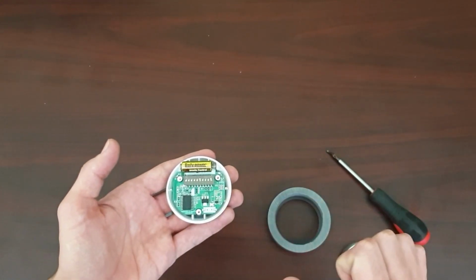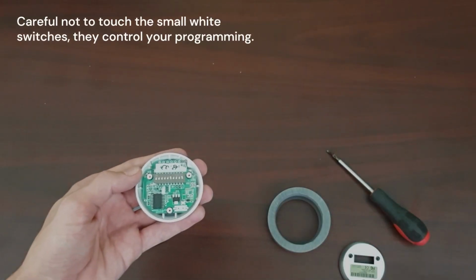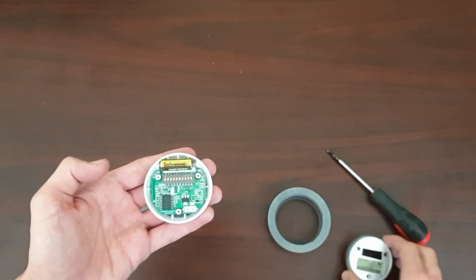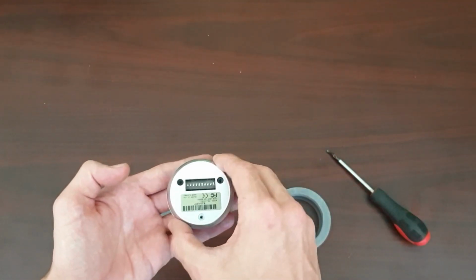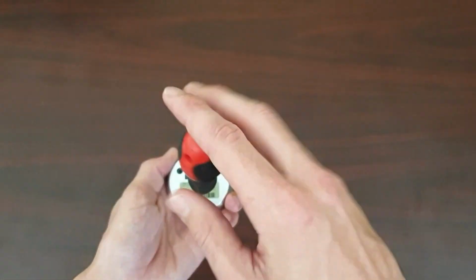You'll see the battery is there. You can then remove the battery, grab another one, and replace it. Once that is done, you put the cover back over, you take the screwdriver, you tighten the screws up.